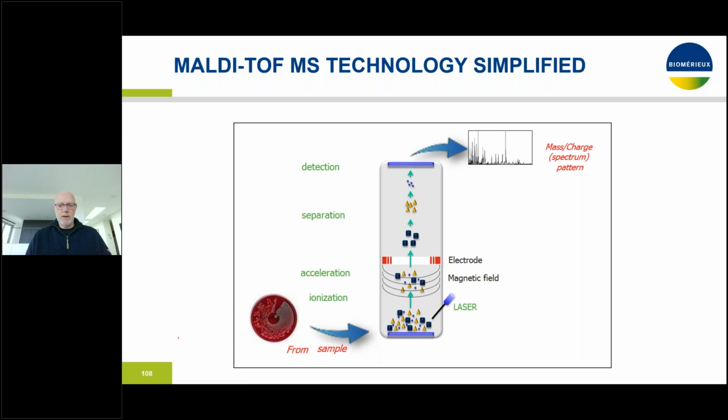But still, this is not the talk of today. This is about mass spec and the fact that directly from a clinical specimen plated on a selective growth medium, you can identify a species. And I want to highlight two negative aspects of the technology here, because you are all aware of the fact that has been alluded to by the previous speakers, that you need your biological material, you need some chemical to facilitate ionization, and then you need to accelerate the ions.